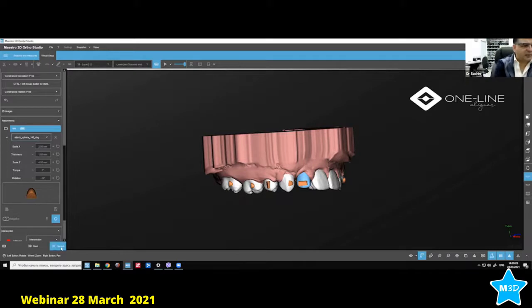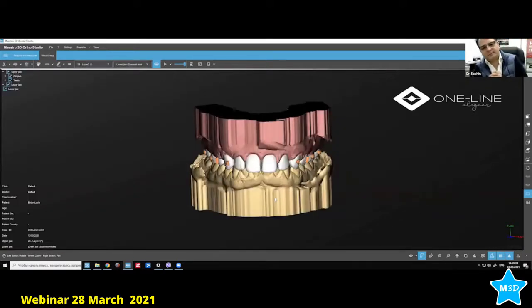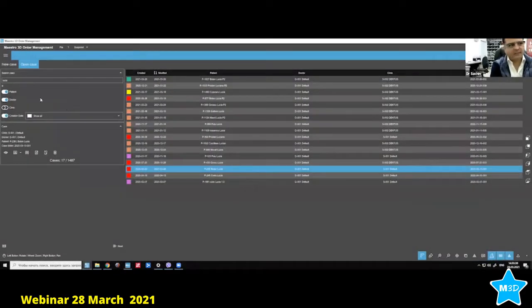So I'd just like to show you one patient also. We did some changes with the attachment. If I find that I like it, I'd like to show it to you and just share it with everybody. This is for intermaxillary elastics.